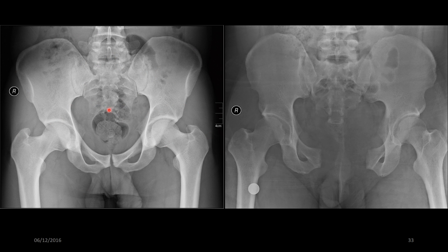And then you move on here, and you've gone to resus. You're a radiographer. You've gone to resus, and you've checked this image, and oh, you've got that. What we're looking at here, again, is a life-threatening injury, and this is what's called an open book fracture. Now, the pelvis, as I said, is a ring structure, almost folded like a book. And what happens is if you're run over by a vehicle, it can split that.